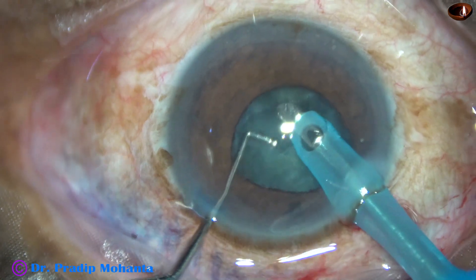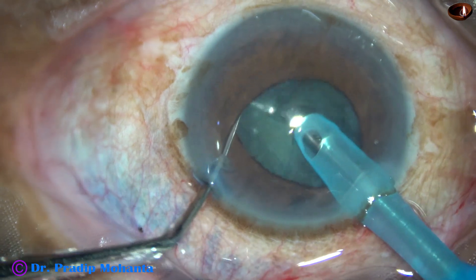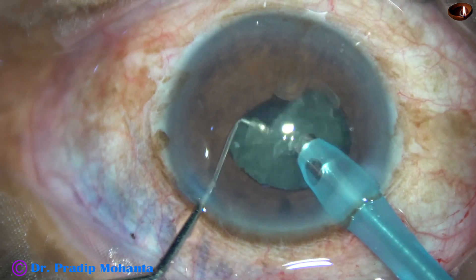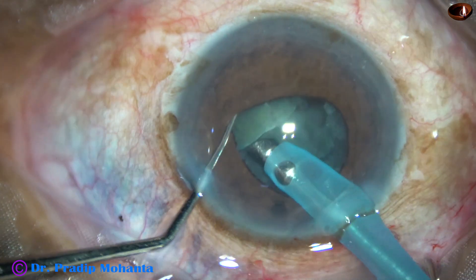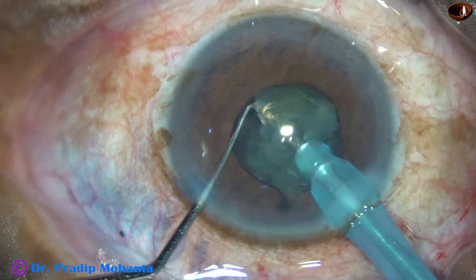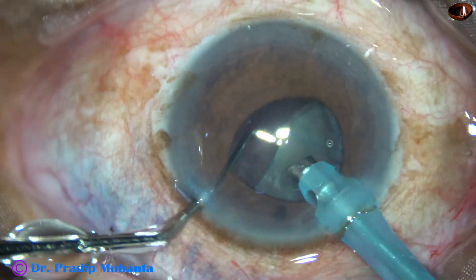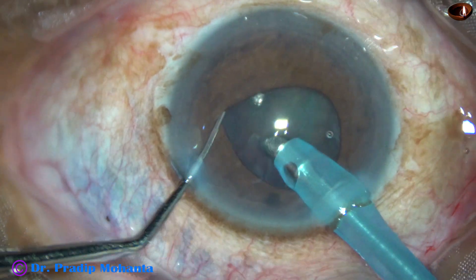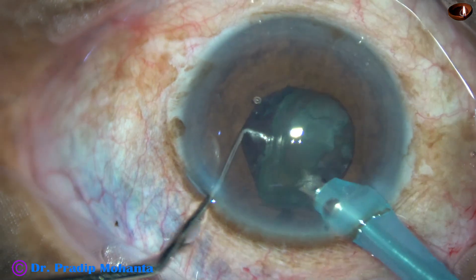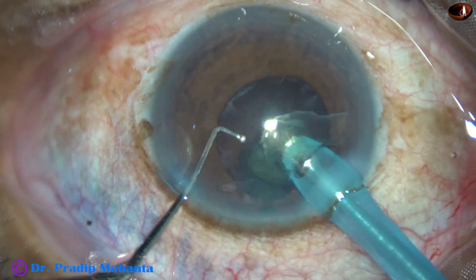You can see the signs of floppy iris. The iris dances and the pupil becomes more small. So the pre-chopper has helped in such cases. If I had tried to manage the nucleus by the phaco tip, it would have been more difficult. We have to be careful not to catch the pupillary margin in such cases.